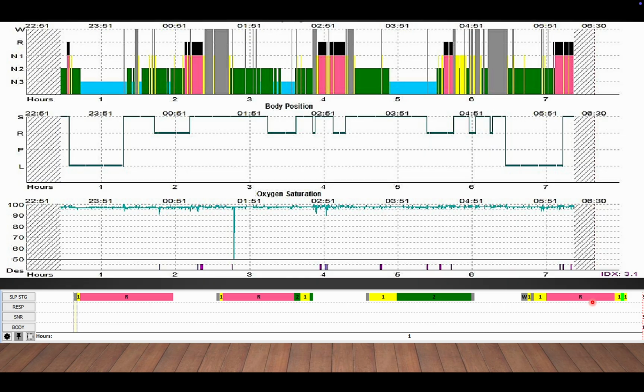So the shorter 4-nap trial can be done if the diagnosis of narcolepsy is made by the presence of a mean sleep latency less than 8 minutes and 2 or more SOREMs in the MSLT alone, or 1 MSLT SOREM plus 1 PSG SOREM. So if you have that classic confirmation, we can end at 4 naps. If not, 5 have to be completed even if there was no SOREM at all.